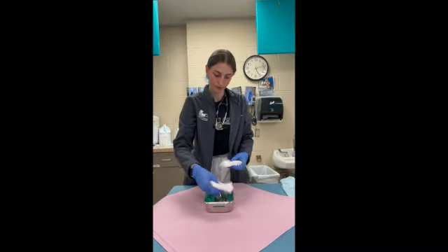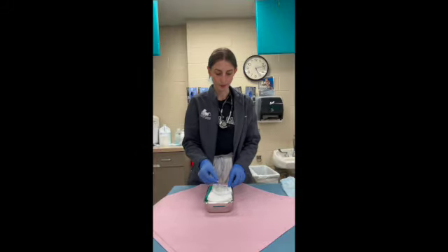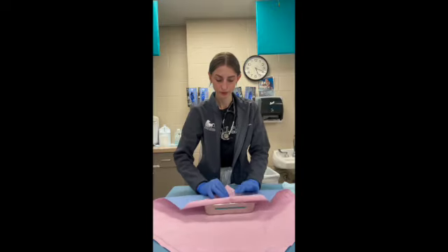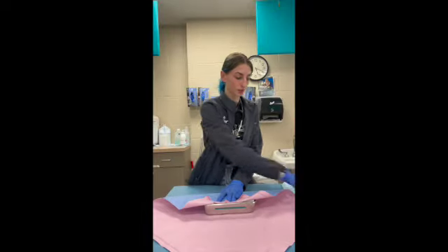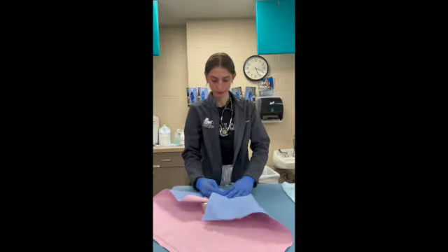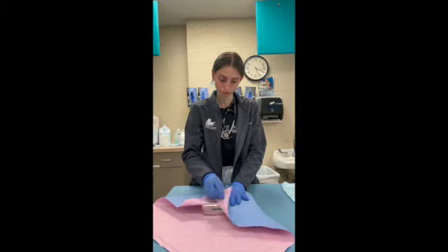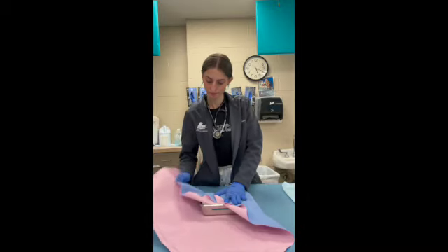Alright, I'm going to take my opaque gauze. And then look at my indicator. You're going to take your 6 o'clock piece and fold it over. Then take the left side, and then your right side.